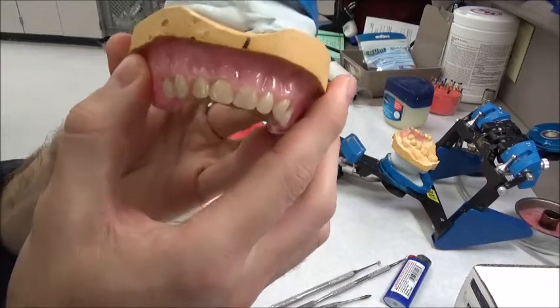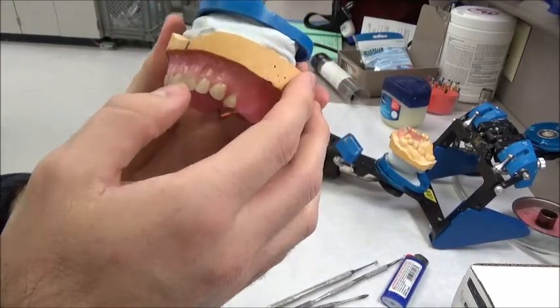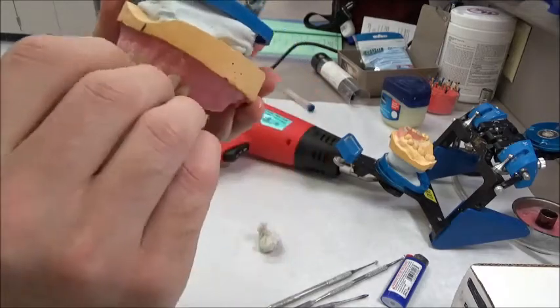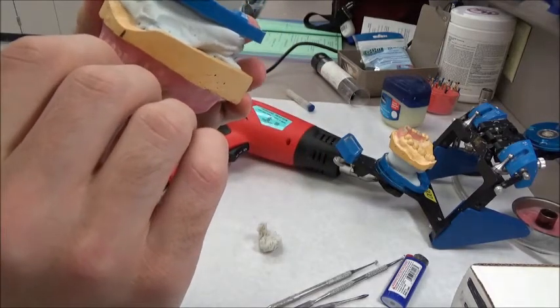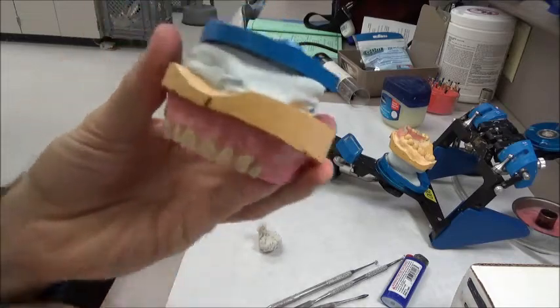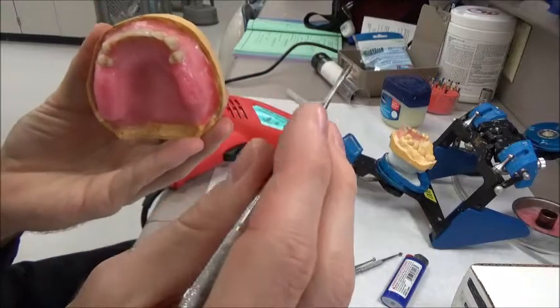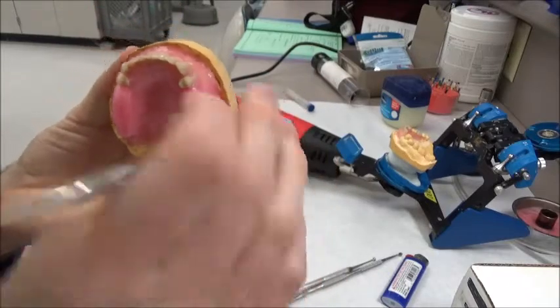I'll probably go in there, shape a little bit more, and then do it again. The only thing I see here is that it melted onto the tooth a little bit, but that's okay. You go back and you shape that up with your wax spatula, the number seven.